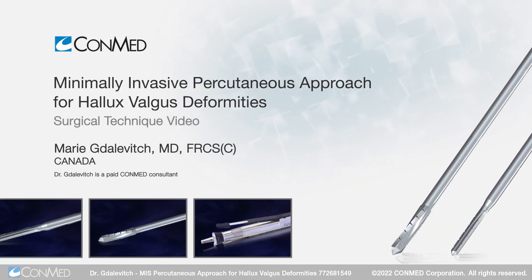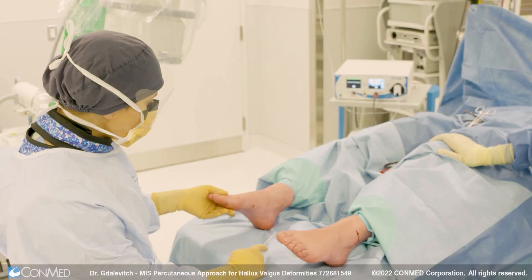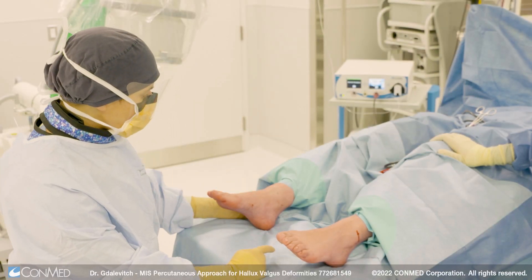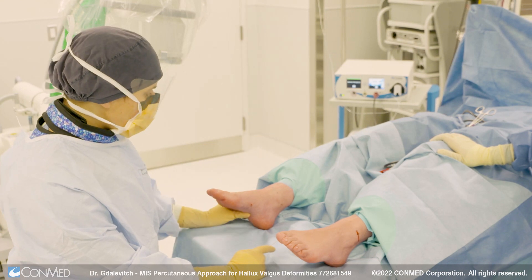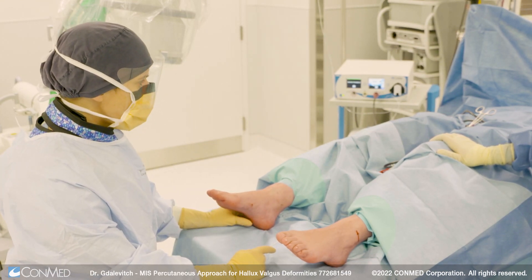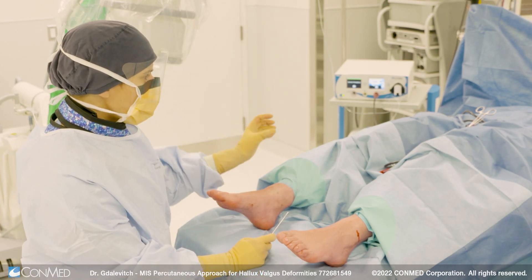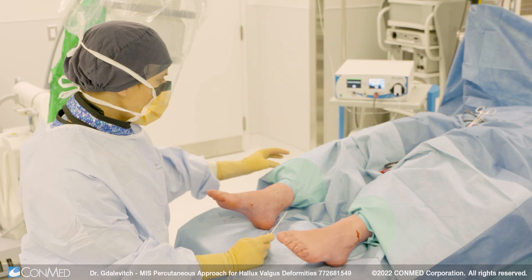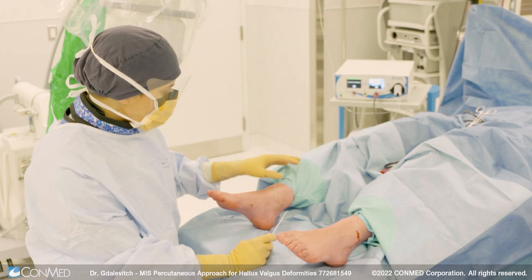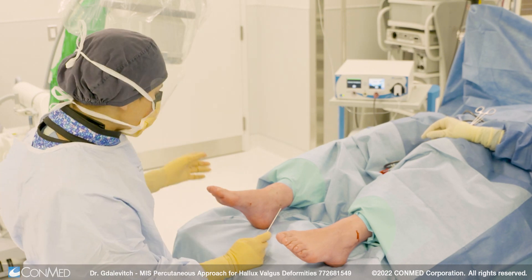My name is Dr. Marie Gudalovitch and we're going to be doing the MIS technique for the percutaneous bunion today. The patient has an ultrasound guided ankle block done and they can have sedation or no sedation for this procedure. That's done in the block room and the patient is brought into the operating room, placed supine on the table with a small sand bump under the hips and a bigger bump under the knees for a little bit of knee flexion to permit a nice AP radiograph of the foot with the C-arm.